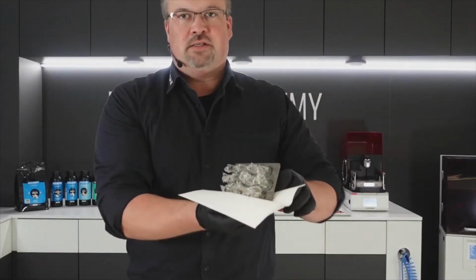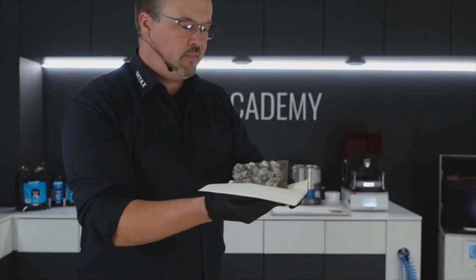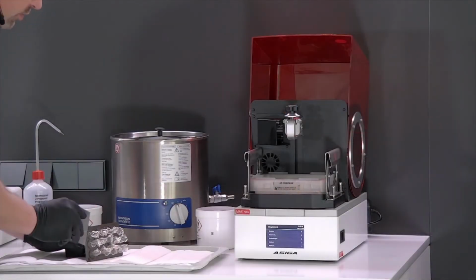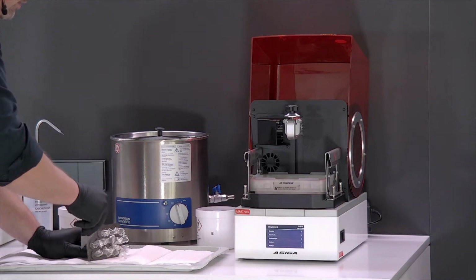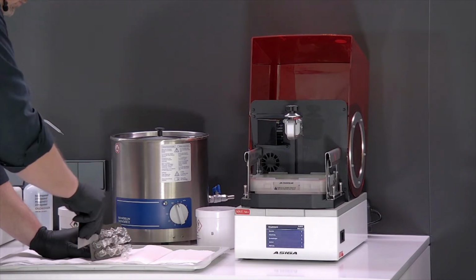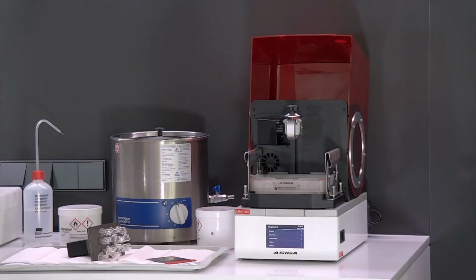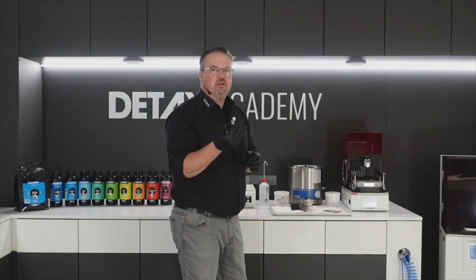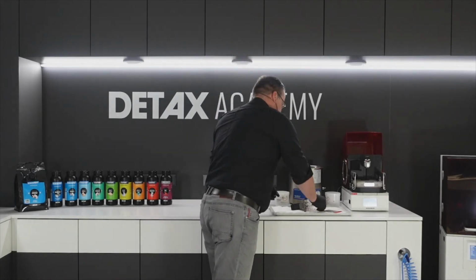You can see here, I will show you also in detail. The objects are directly connected to the platform. And we can lose it easy with a silicone spatula here inside. Go under the objects and lose it from the platform. On the surface of the objects and also inside of the objects is the rest liquid material. So we don't need the material. That means we need to clean it.